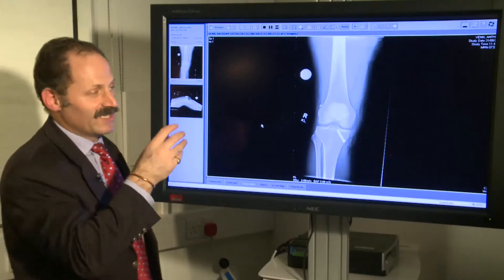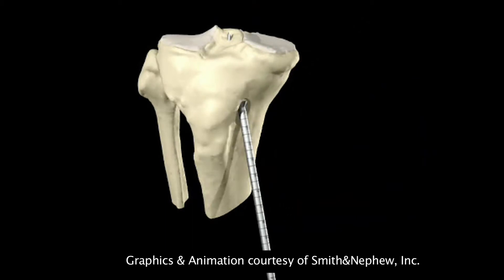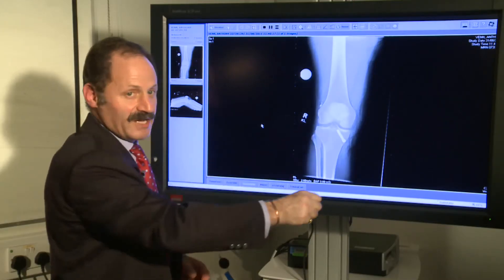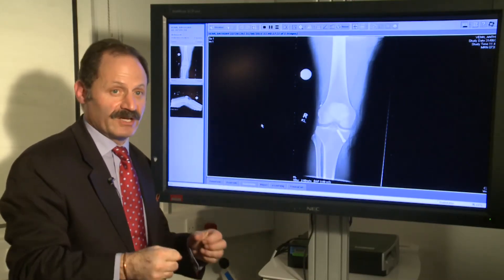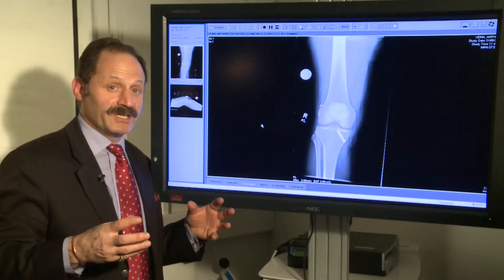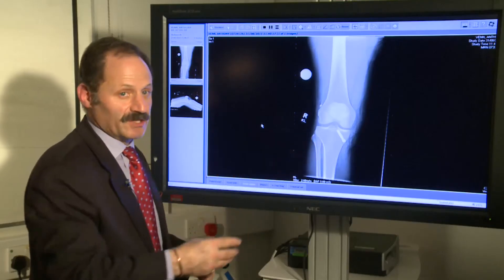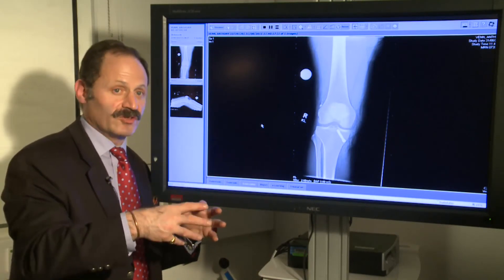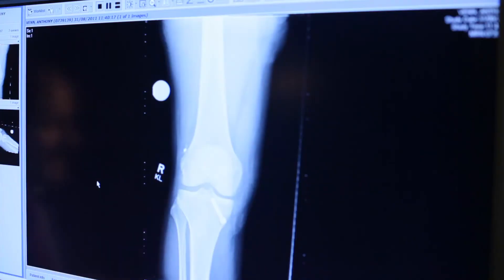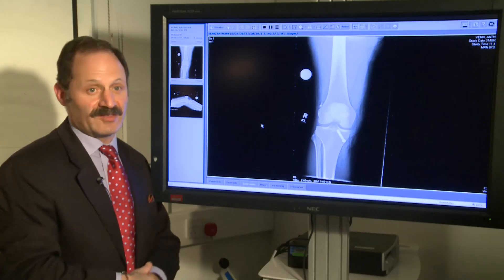In the shin bone tunnel we've again become more anatomical over the last few years, and we've now put that exactly where the old ACL used to be. Having pulled the tendons through the tunnel and tensioned them to get the right tension, this screw goes into the tunnel. It's what we call an interference screw — it literally squashes the graft up against the walls of the bone to stop it slipping. The screw holds it initially, and then the bone will grow into the tendon and heal it in there — you get natural biological healing. That is the interference screw holding it tight in the tibial tunnel.